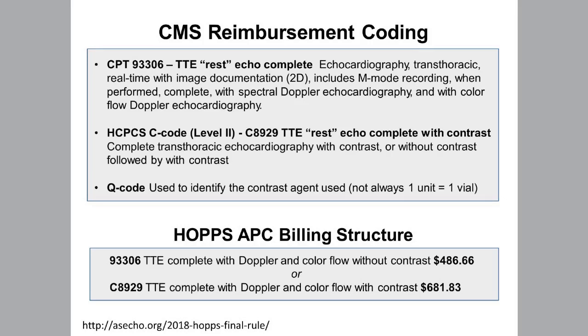Monet? I agree. And I like your idea of a little bit higher MI so that you can actually get the wall, the epicardium as well as the endocardium. That way you can really see how thick that wall is. Yep.